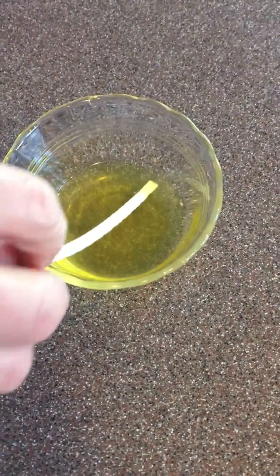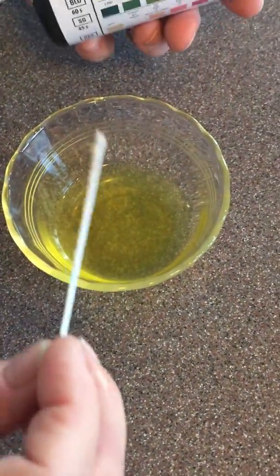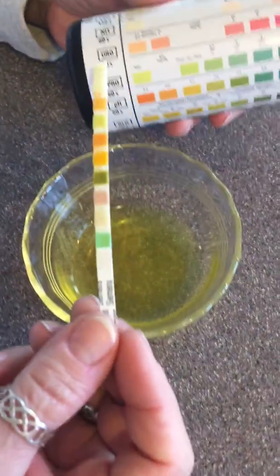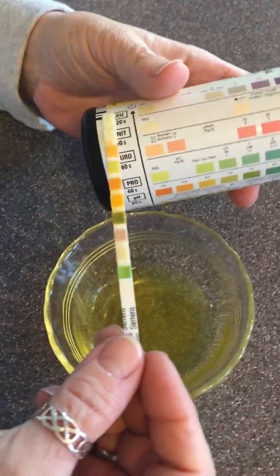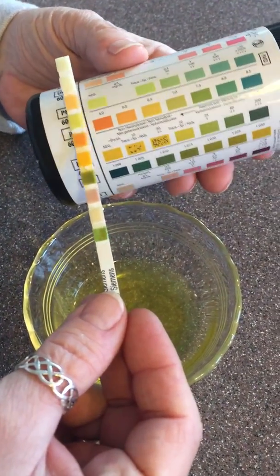Sometimes we do it because we want to test the urine for the presence of infection, but we also test it when we have a diabetic, which is the case today. And so we dip the whole stick in. And for some of you, this is what's going on at the vet in the back. And so you'll see the strips correspond to different values. And we line it up, and there's a different amount of time for each one, but it's very, very quick.